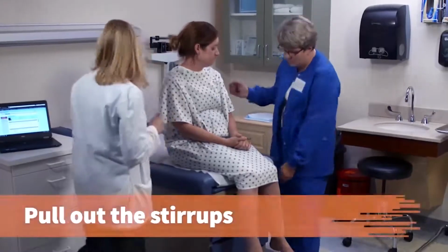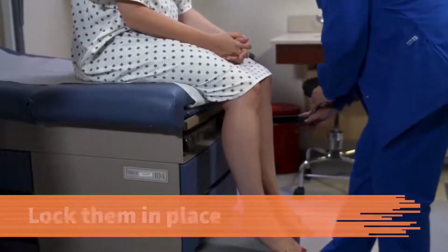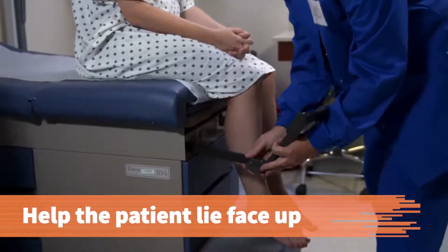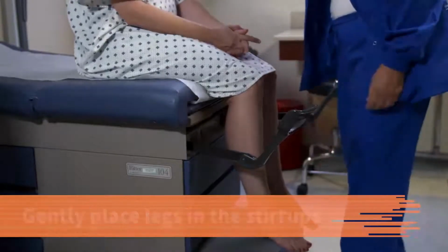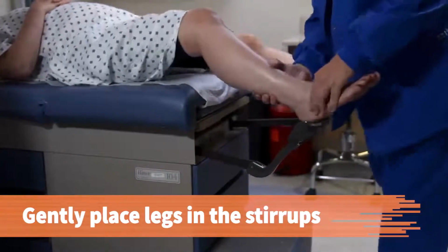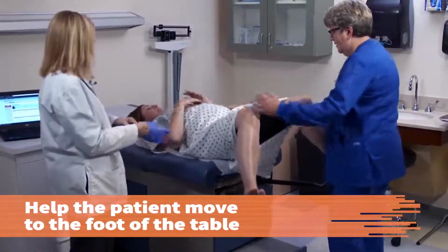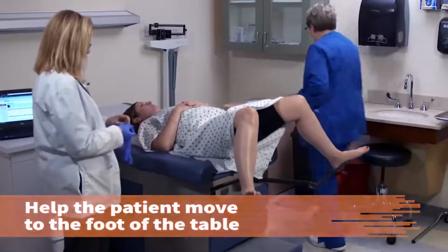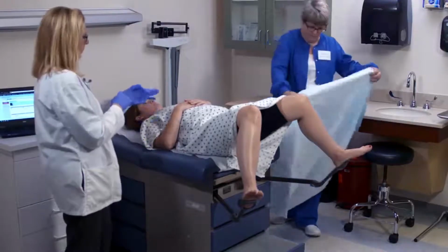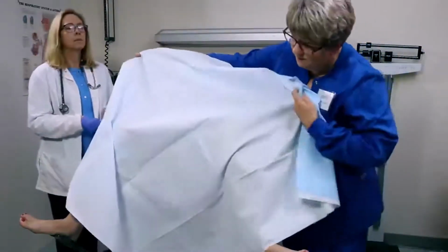Sure. Pull out the stirrups, adjust their extension length for the patient's comfort, and lock them in place. Help the patient lie face up on the table. Gently place the patient's legs in the stirrups, checking for comfort. Have the patient move toward the foot of the table with her buttocks on the bottom table edge. Some offices may stock cloth or paper stirrup covers to protect the patient and make the position more comfortable.